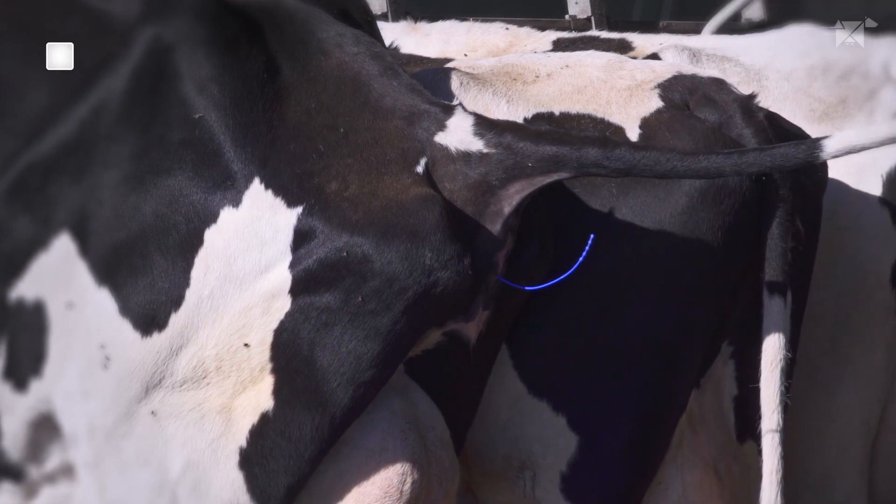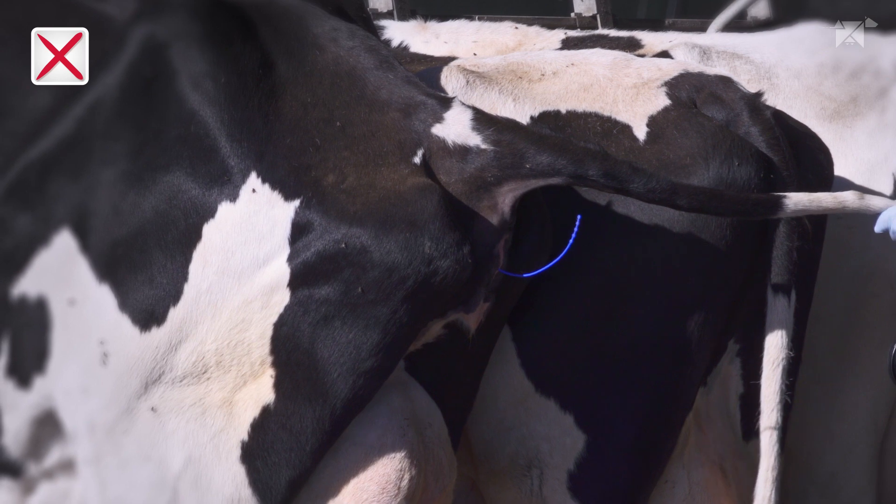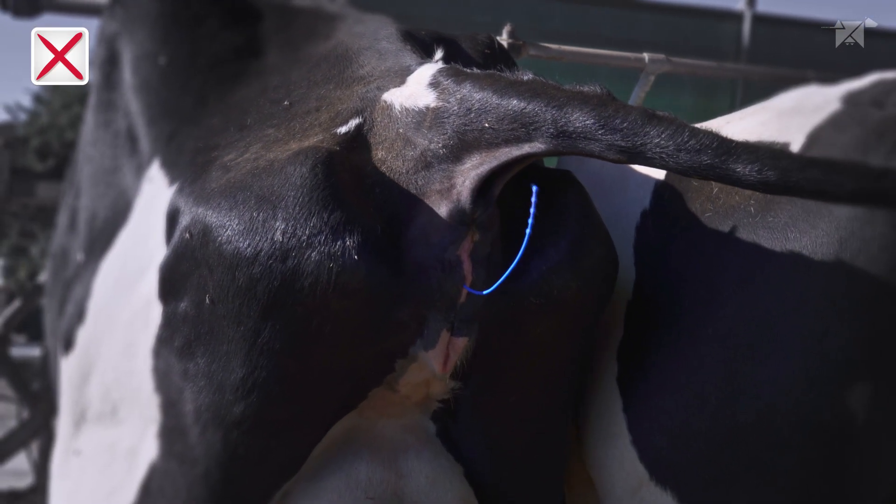It is important that the tail of the device is directed downwards. In this case, the tail of the device is upwards, and it is necessary to reintroduce the Predelta correctly.